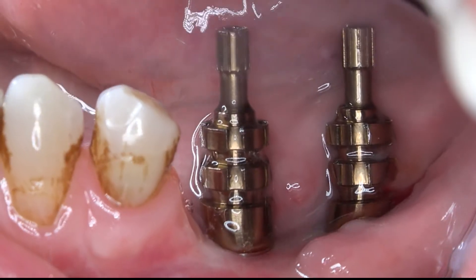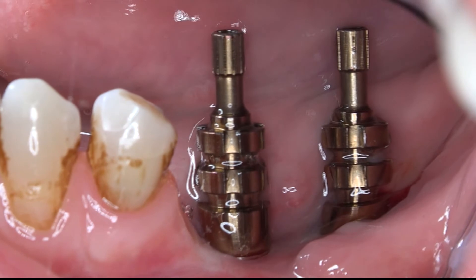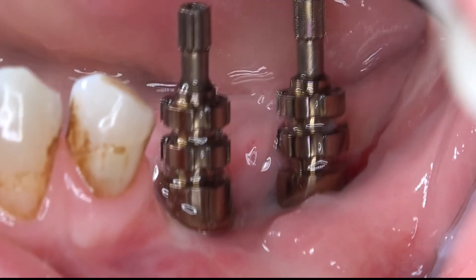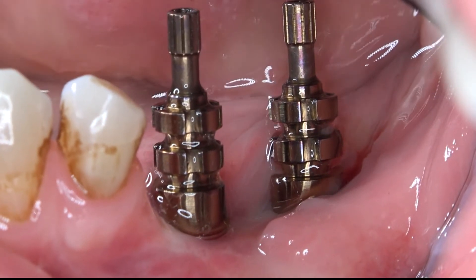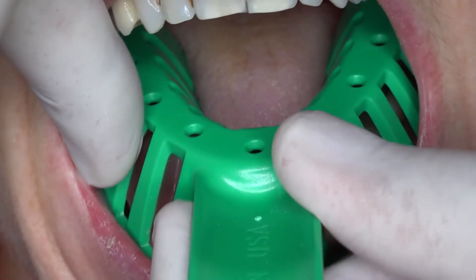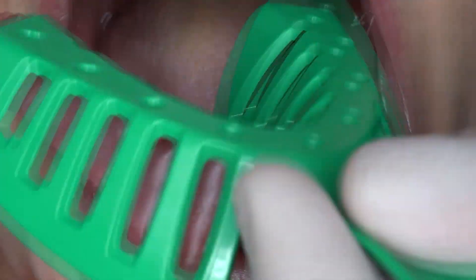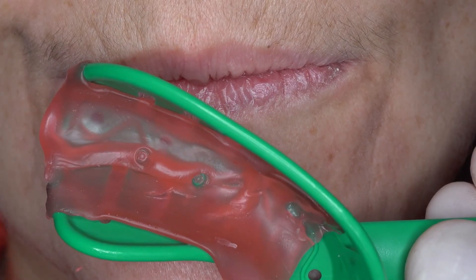For all screw-retained fixed partial dentures, open tray and splinted implant impression making is necessary. After fixing the sterile multi-abutments intraorally to prevent their further removal, open tray impression posts at the abutment level should be used. In order to open an adequate number of screw holes on the impression tray, a layer of wax is placed inside and pressed on the post screws to make their prints.